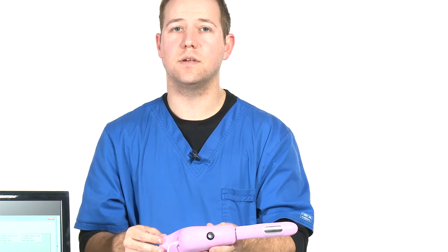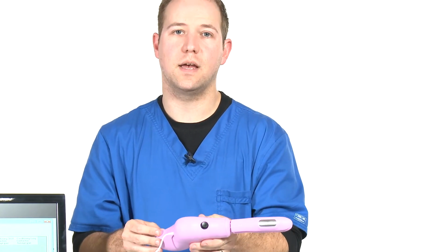The patient will then subsequently come in 1 month from today's date for their next checkup. So a 2-week checkup, 6-week checkup, and 10-week checkup. At the 10-week mark, if they have stress incontinence, they should be able to indicate at least an 80% improvement in their reduction in leakage. If they have urge and mixed incontinence, they should still be able to report some reduction in episodes from their urgency or their frequency.